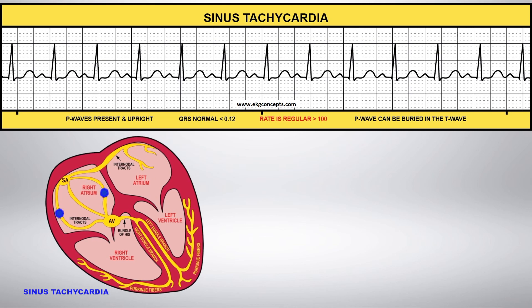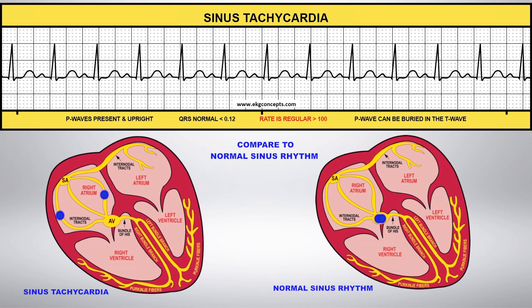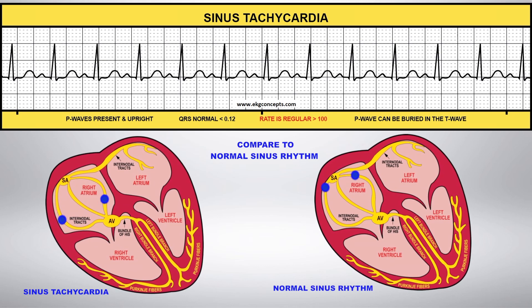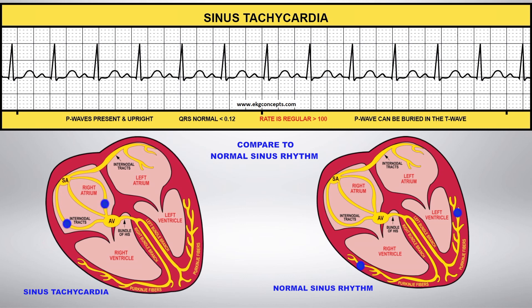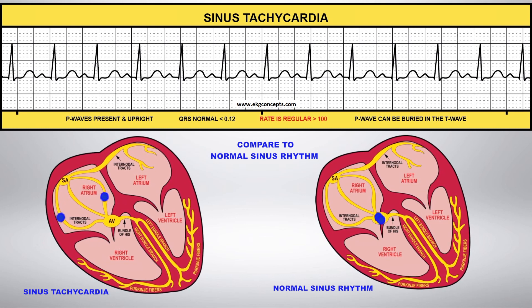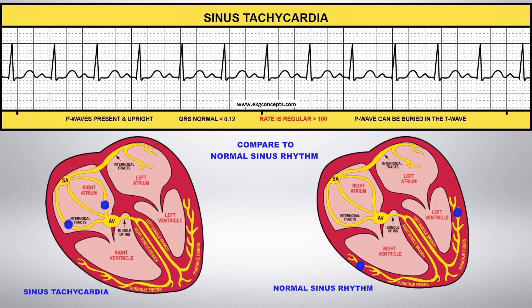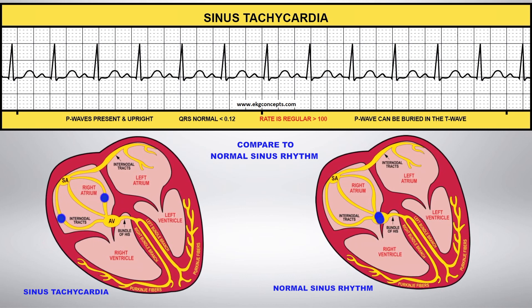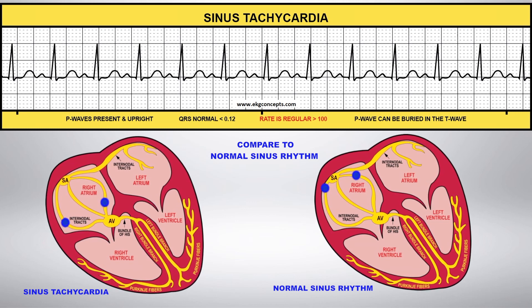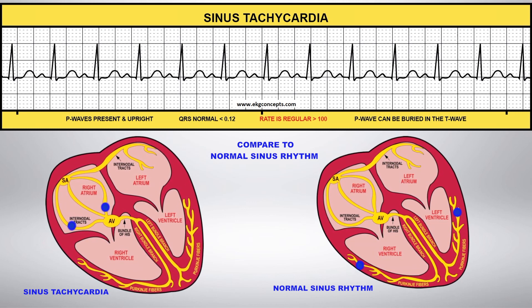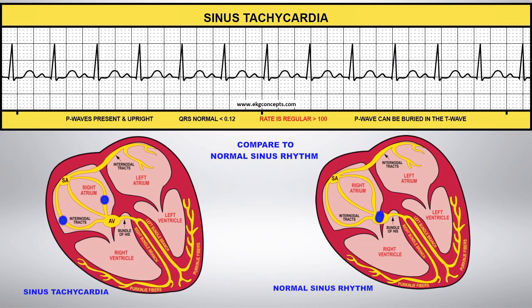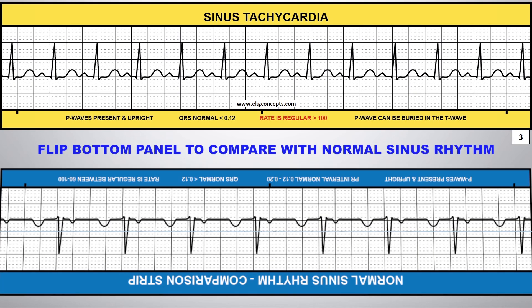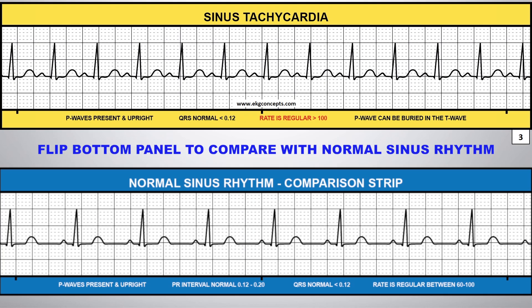Sinus tachycardia originates in the SA node and follows the normal conduction pathway; however, the heart rate is greater than 100 beats per minute. You can flip the comparison strip on the bottom panel to compare this rhythm to normal sinus rhythm.